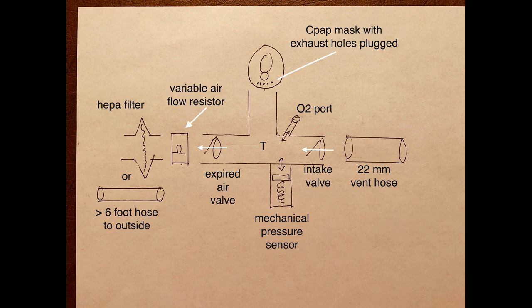So I hope this video gives you engineers and makers some idea of how to make a simple CPAP machine.